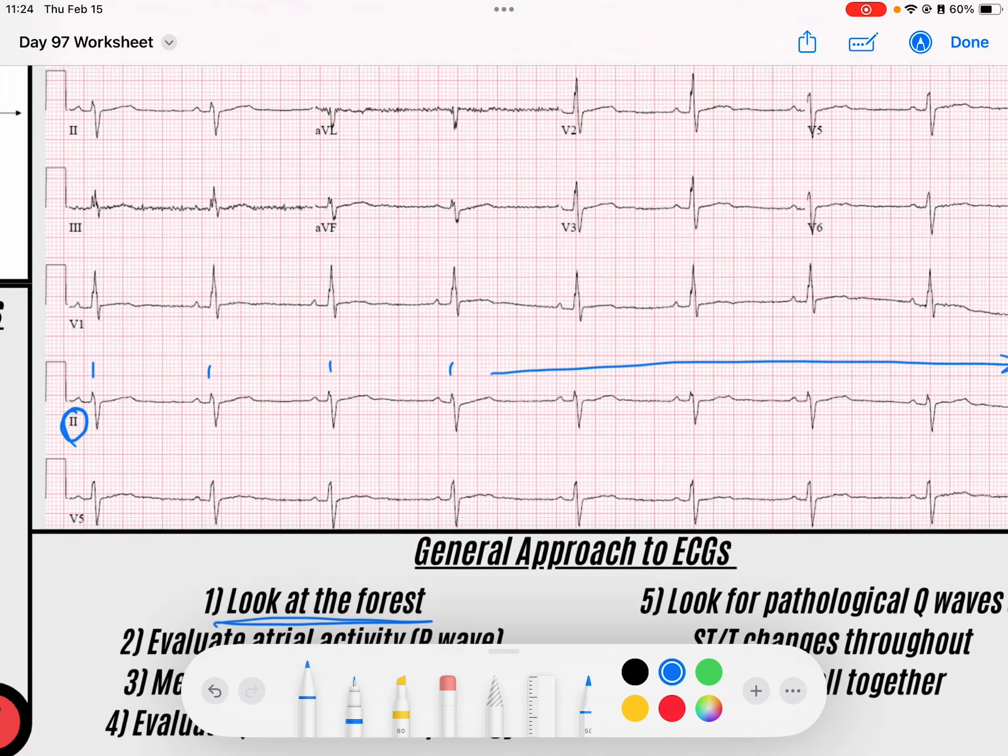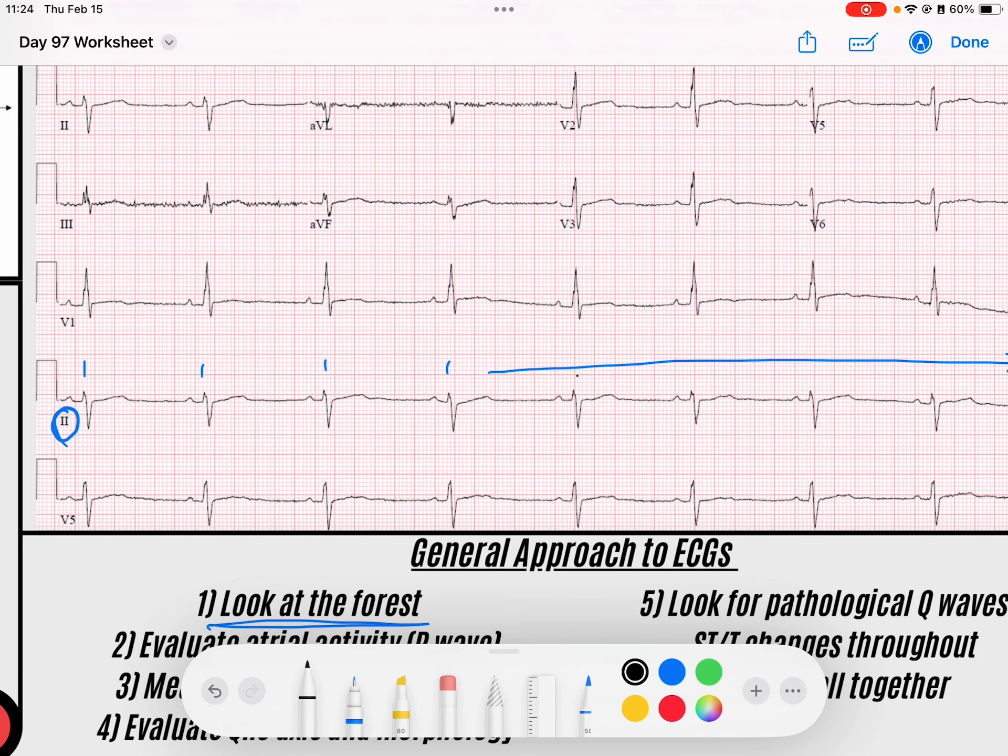If I want to get an average rate here, maybe I'll choose this R wave that ends on a solid line and we'll go to this one: 300, 150, 100, 75, 60, 50. So maybe we'll call this just over 50, maybe 53 beats per minute. And so we've got a bradycardia.